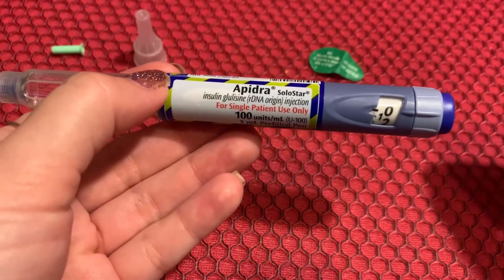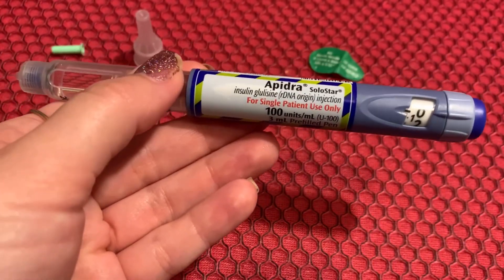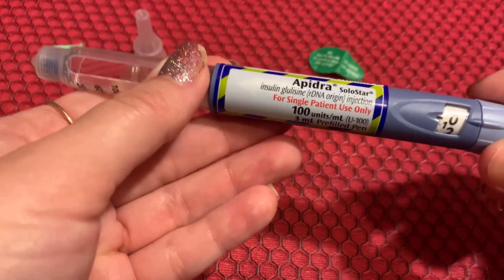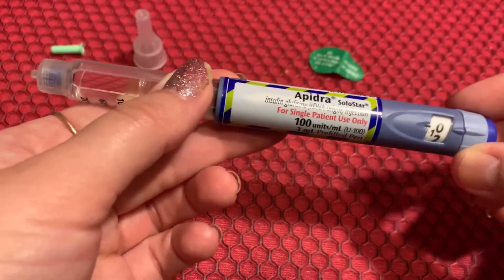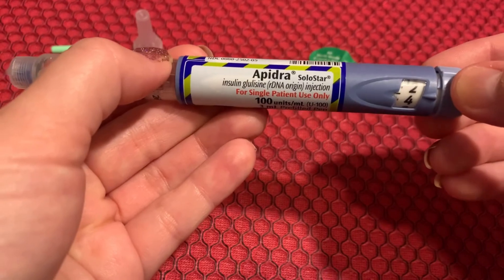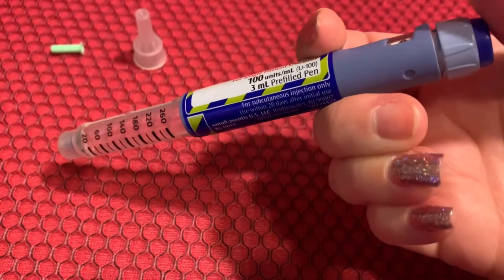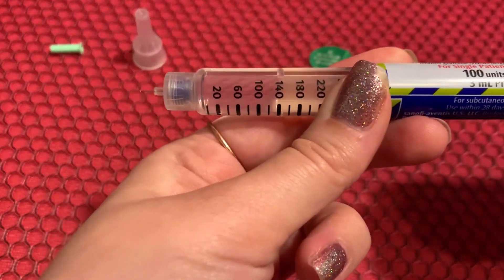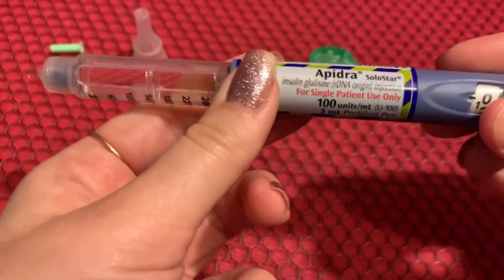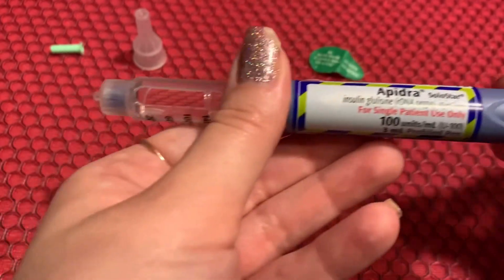Now, every time you are about to inject, you want to prime the needle. This means making sure you don't have a defective pen or that you didn't put the needle on incorrectly. We want to make sure it works before we inject ourselves, because when you inject yourself you won't be able to see if insulin is coming out. When priming, dial up one, two, or three units — whatever your preference is — then push on the plunger and make sure you see a stream of insulin come out or some little dribbles. Especially with a new pen, you may have to do that a couple of times. Every time you use a pen, make sure there is insulin coming out of the needle.